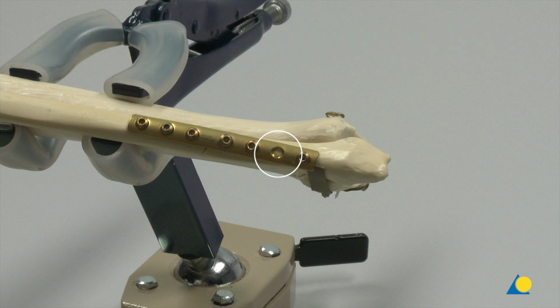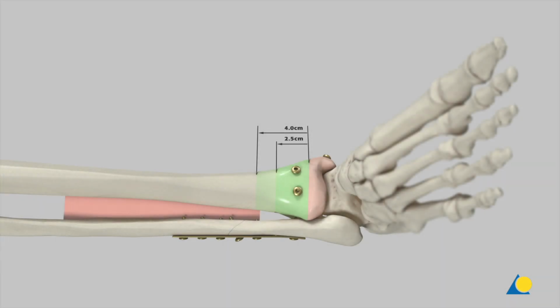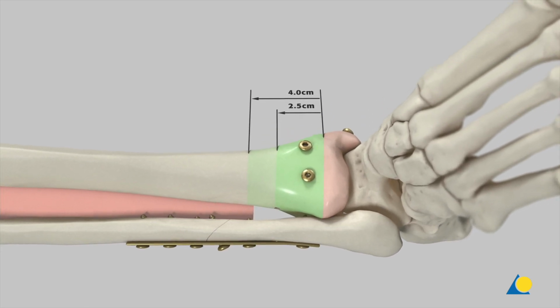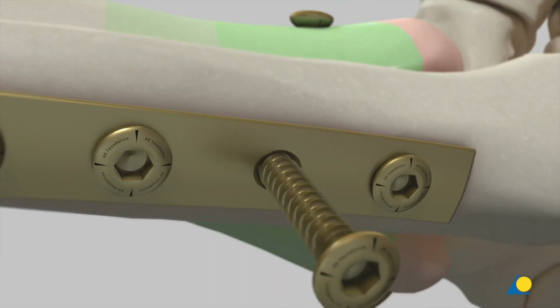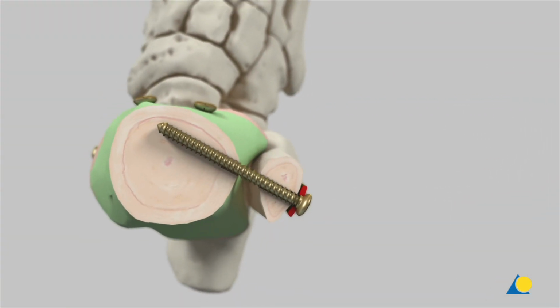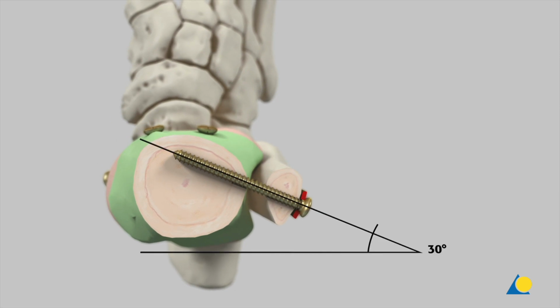In the clinical situation, the ankle is dorsiflexed for the insertion of the positioning screw. This ensures that the upper ankle joint is at its widest position. The screw should be inserted 2.5 to 4 centimeters above the anterior syndesmosis. The screw must be inserted at a 30-degree angle from the dorsal direction and parallel to the tibial plafond.